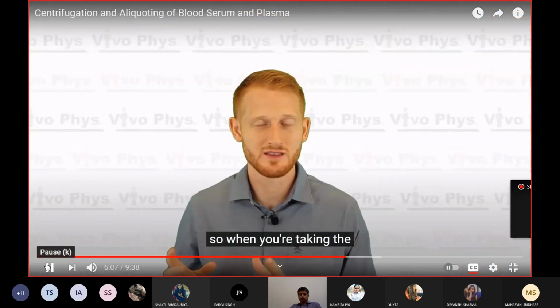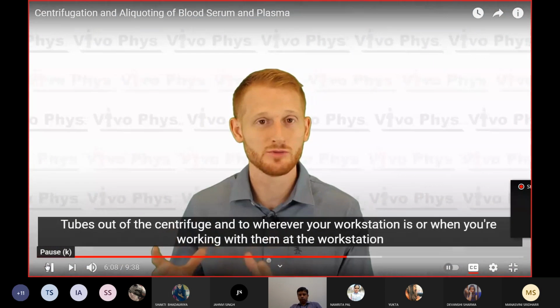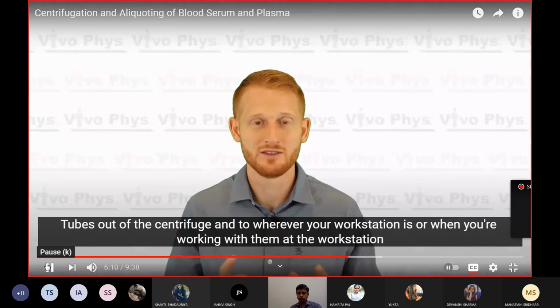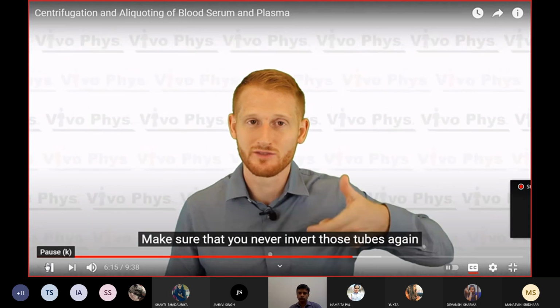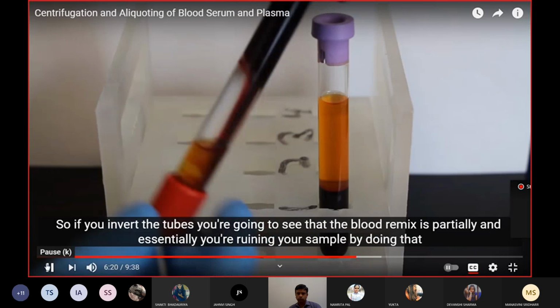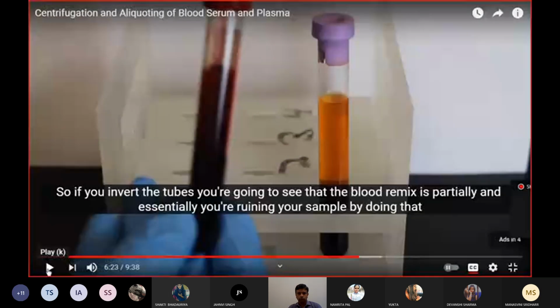So when you're taking the tubes out of the centrifuge and to wherever your workstation is, or when you're working with them at the workstation, make sure that you never invert those tubes again. So if you invert the tubes, you're going to see that the blood remixes partially, and essentially you're ruining your sample. Okay, so you can see once centrifuge is done, you have to handle those tubes very carefully.